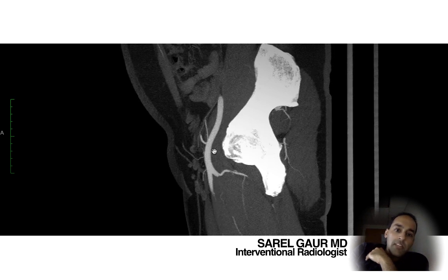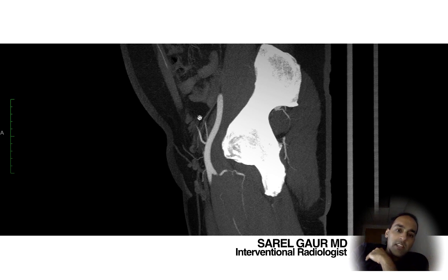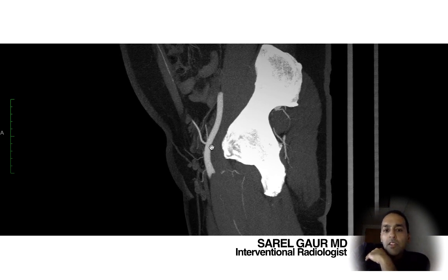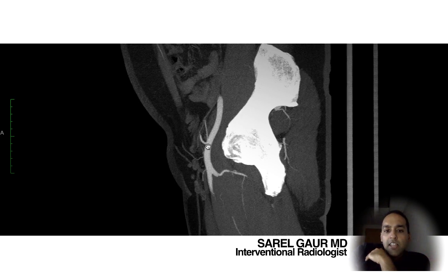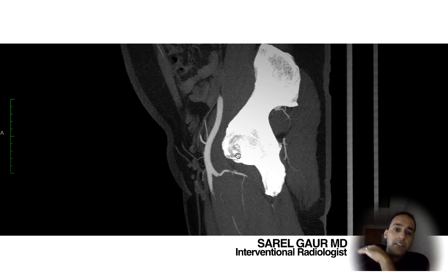Another important landmark is this vessel here. You can see this small vessel coursing anteriorly and cephalad towards the head — that is the inferior epigastric artery. Below this level we have the CFA. From here to here, we have the common femoral artery, common because it splits into the SFA and the profunda femoris. Importantly, this is right at the level of the femoral head.